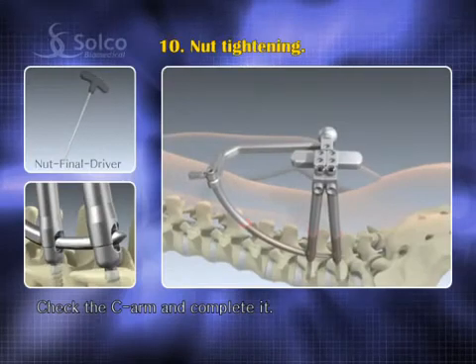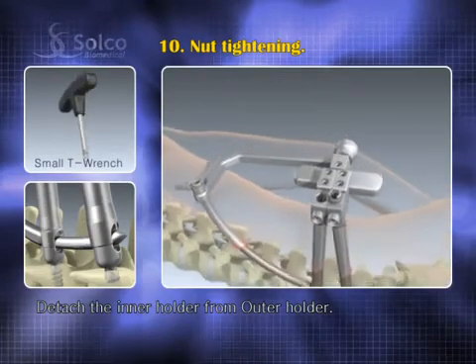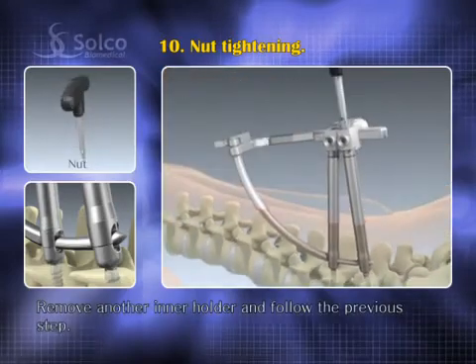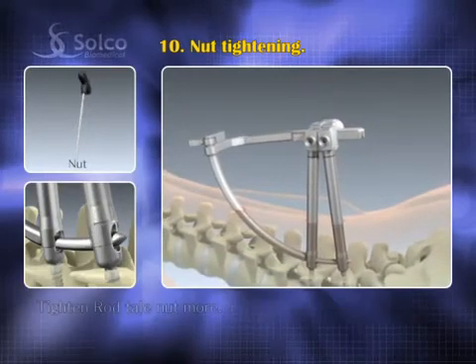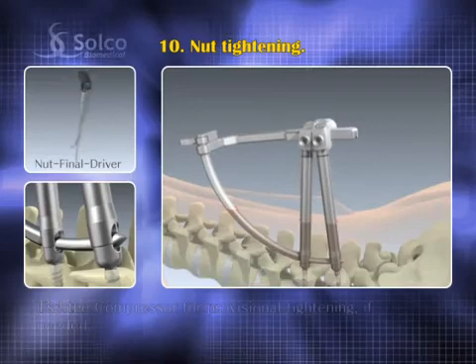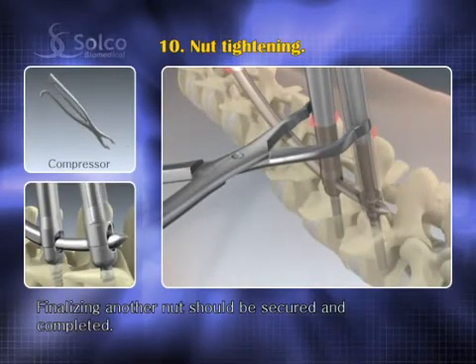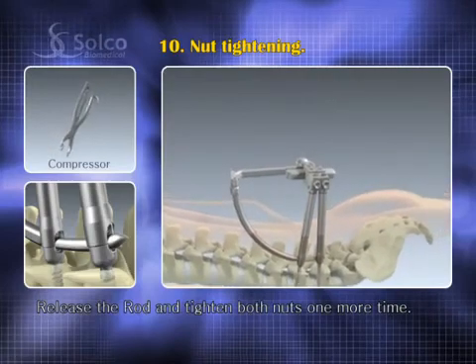Check the C-arm and complete it. Prior to nut tightening, detach the inner holder from the outer holder using the small T-wrench. Use the nut starter to engage the nut on the screw head from the rod tail. Remove the other inner holder and follow the previous step. Tighten the rod tail nut more. Use the compressor for provisional tightening if needed. Finalize the tightening — another nut should achieve a secure and completed finish. Release the rod carefully and tighten both nuts one more time.